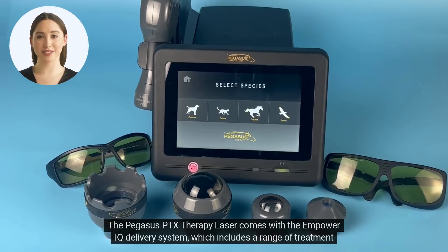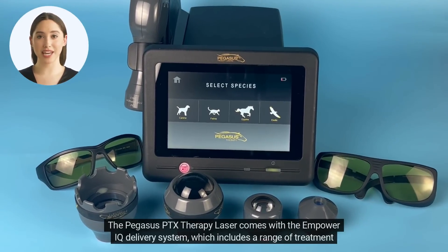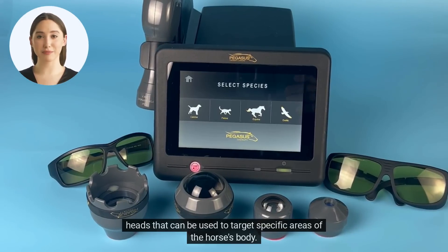The Pegasus PTX Therapy Laser comes with the Empower IQ Delivery System, which includes a range of treatment heads that can be used to target specific areas of the horse's body.